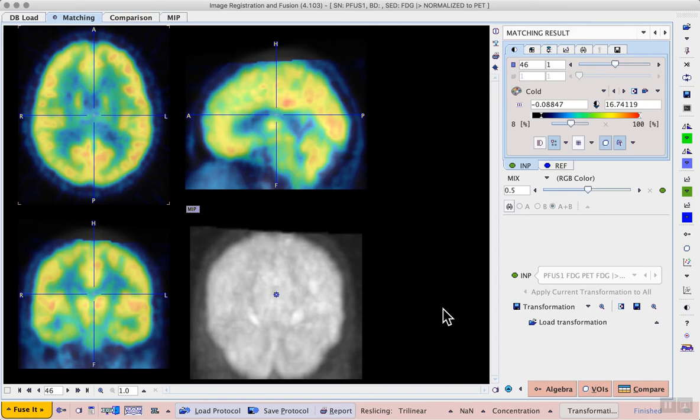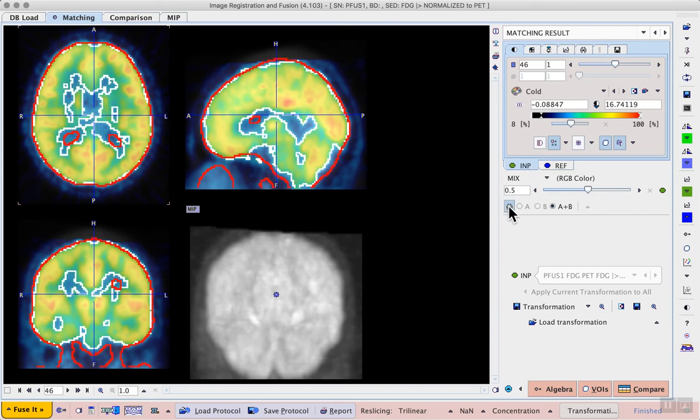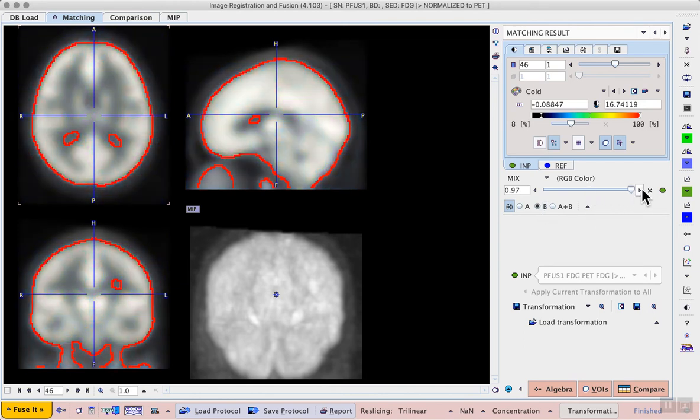So on the matching result page the result can be easily assessed by displaying contours for the template and using the fusion controls as before. From the lower part of the fusion controls we can turn on contouring which initially shows contours for both A and B so for the input and the reference. If we select only B then we see only a contour for our template. If we use the fusion slider we can see how that contour corresponds to the template.